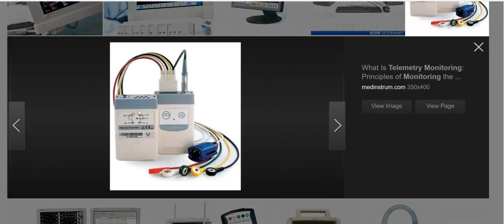This is an example of a telemetry monitor. You do not have to be a registered nurse to apply a telemetry pack if your facility has provided specialized training to a technician to do so. What's important is that we make sure we never delegate the education that goes along with the instructions that we should provide to a client who is going to be on telemetry.